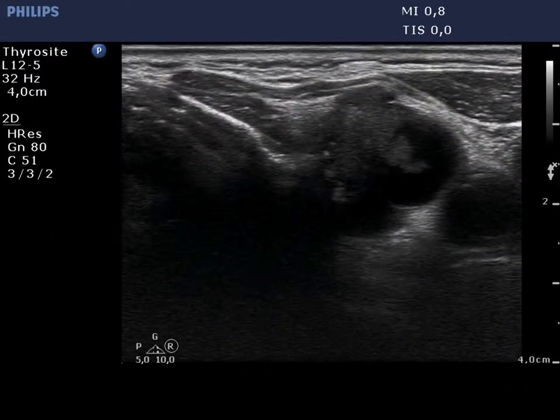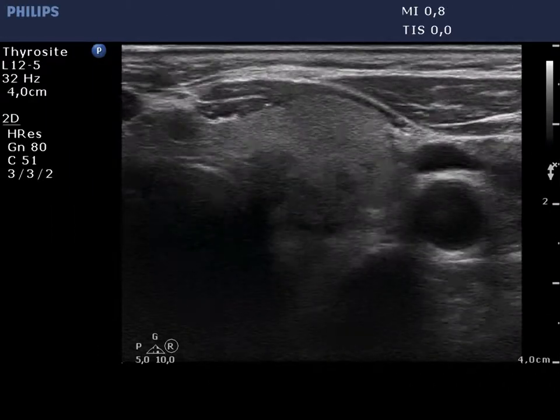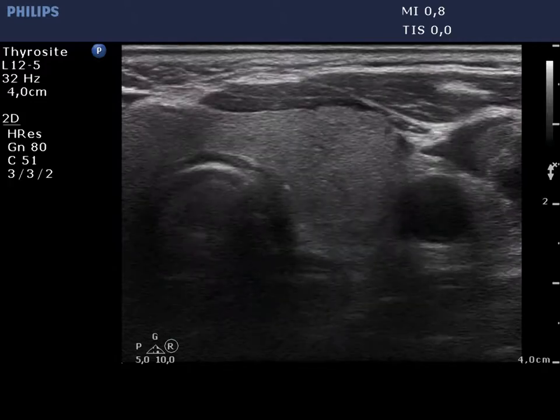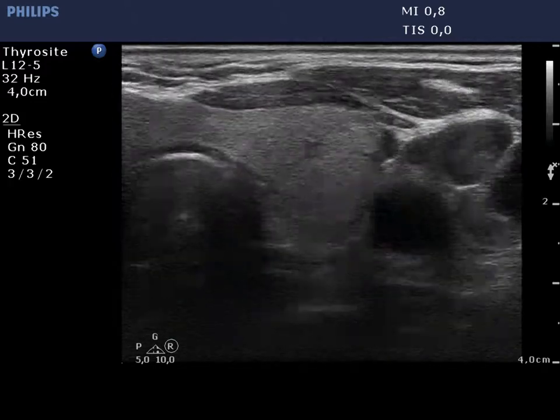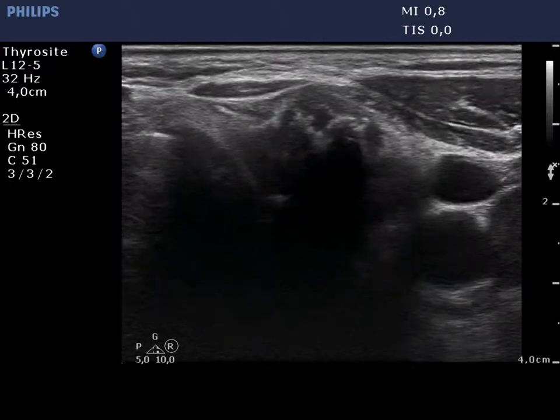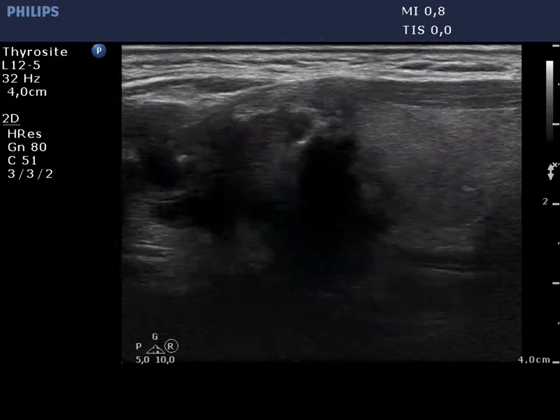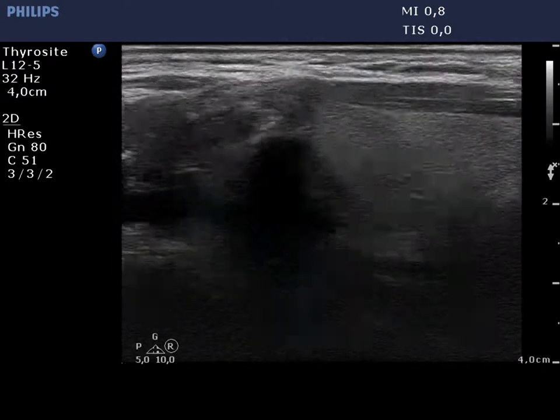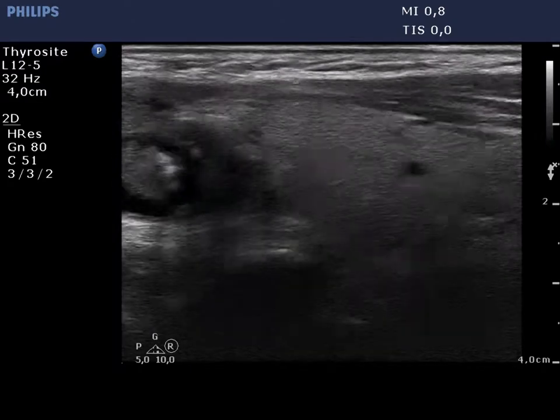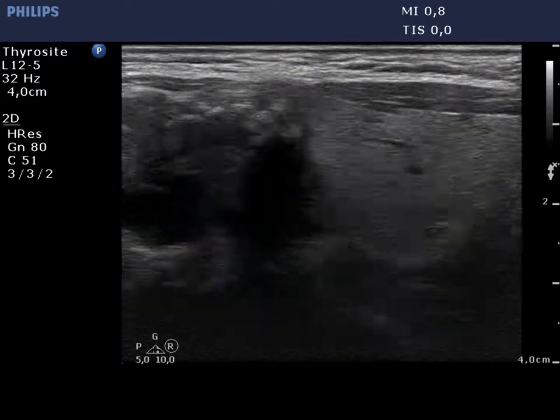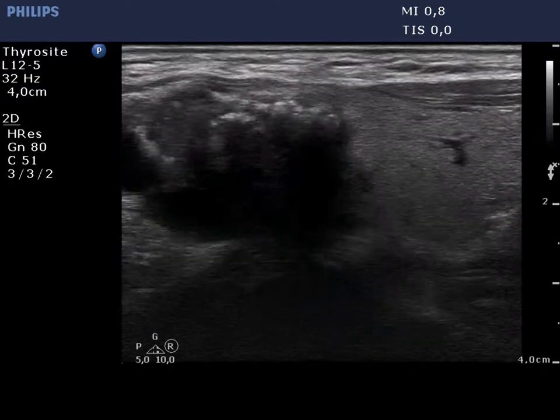There is an irregular, mixed solid-cystic nodule in the upper part of the left lobe. The nodule presents relatively large hyperechoic granules. These may correspond partly to groups of microcalcifications next to each other, and partly to coarse calcifications.